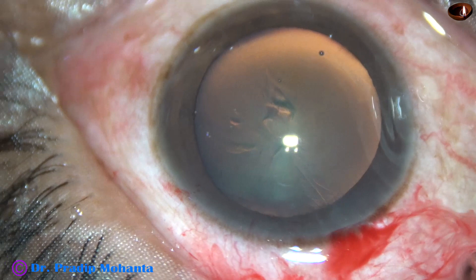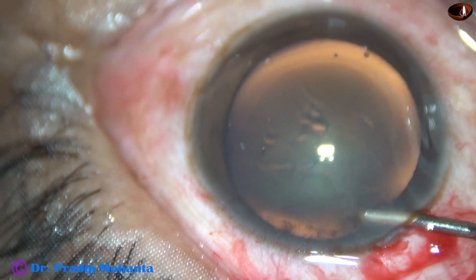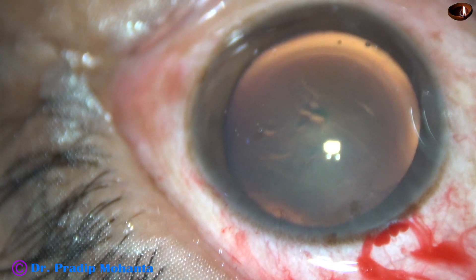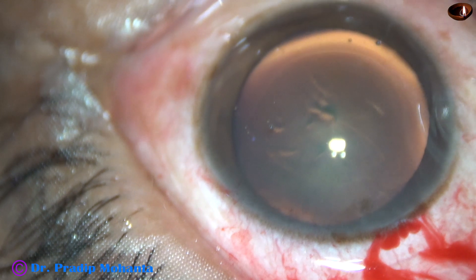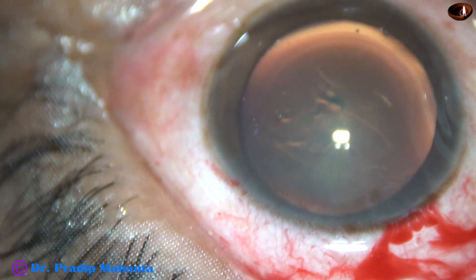So what next? What should we do now? Inject some visco, take a Vannas scissor, go through the main wound, and start the rhexis from the other side.